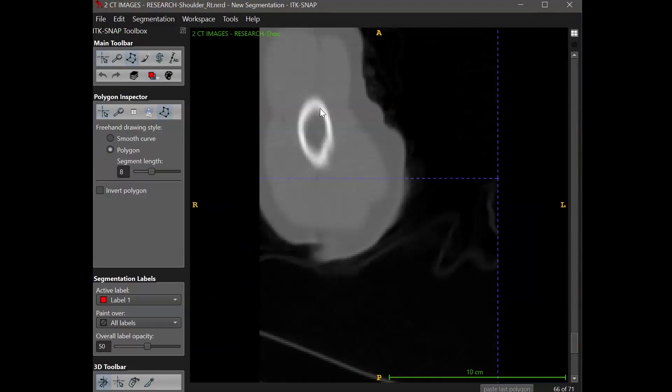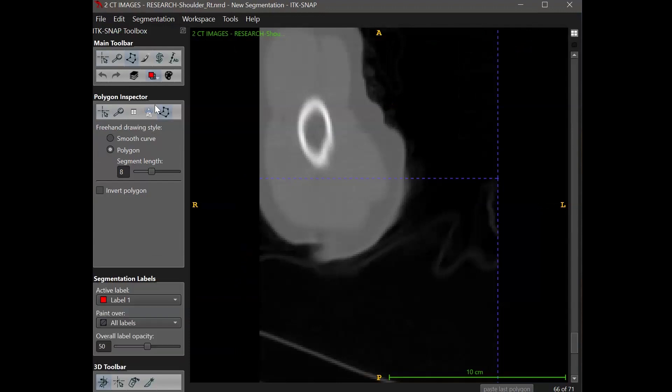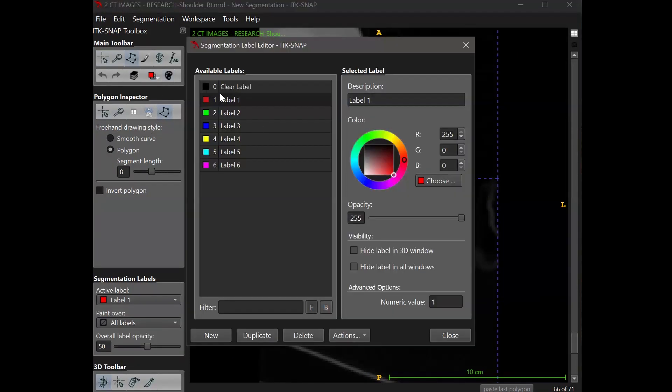Perhaps I want to create a label for the medullary cavity and call it marrow for short. I could also create another label for other bones like the scapula.